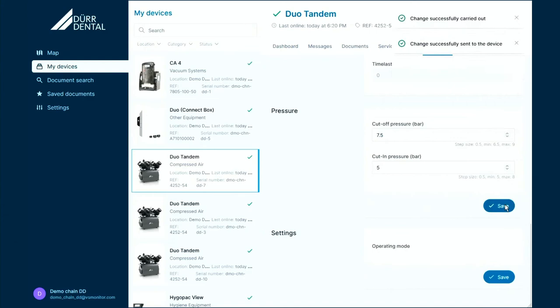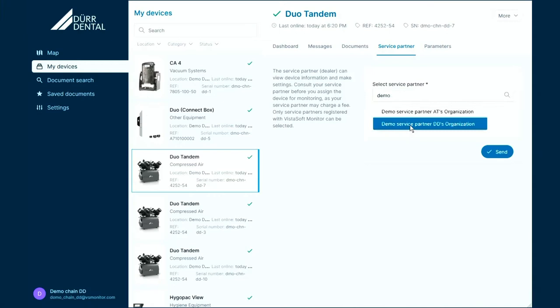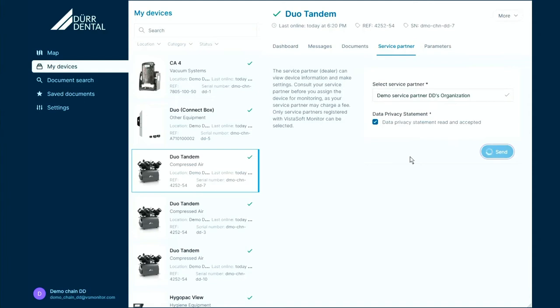This functionality can also be given to your participating service provider by simply going to the service partner tab and entering your service provider. Your service provider might offer the monitoring and remote service in the frame of a service contract, so be sure to check with your service provider.